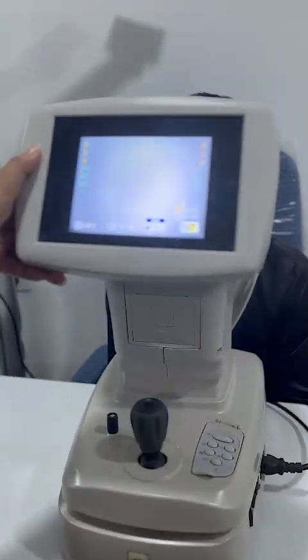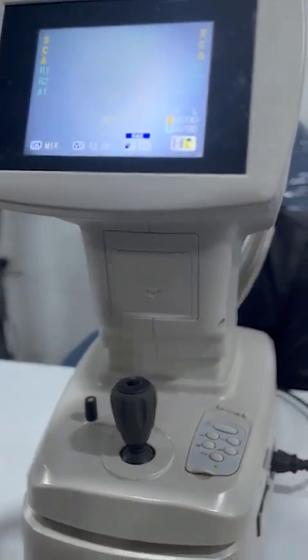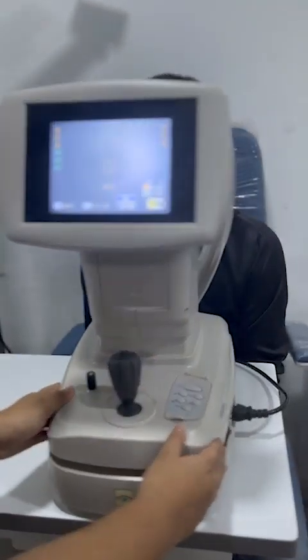This is the printing area. You can change the ink and paper roll from here, and you can scroll up and down from here. Now we will go to settings.